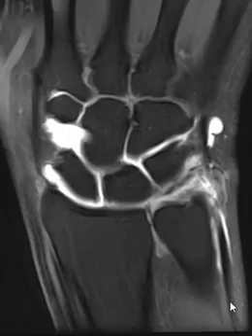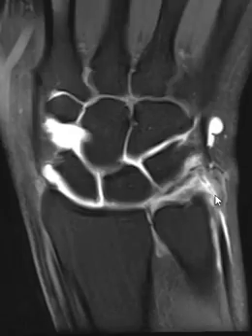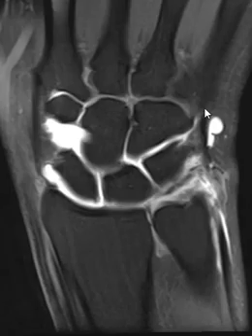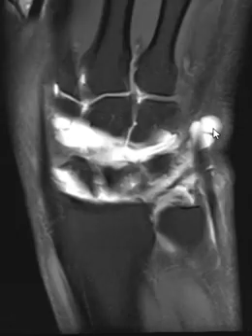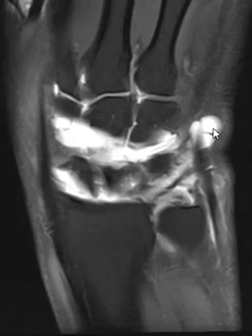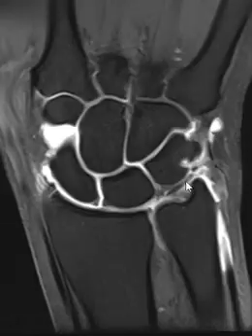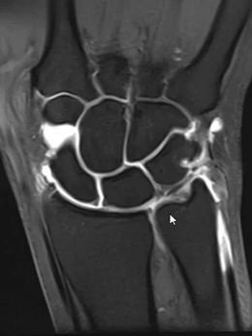Some of the contrast even comes up around the distal part of this ECU tendon. The extensor carpi ulnaris tendon comes up here and attaches distally at the base of the fifth metacarpal. We'll see on the axial images just a little bit of fluid over the top of that. So again, this is a large extensive tear involving all parts of the triangular fibrocartilage.